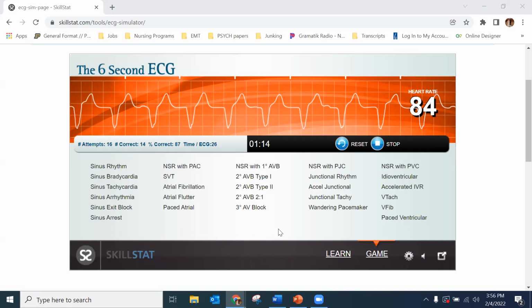Is that the PVC? So good question, actually. The PVC is just one beat that comes early every so often. So overall, I have a relatively normal rhythm, and every so often you'll see a wide complex. With this particular rhythm, every single beat is a wide complex, so that means the whole thing is coming from my ventricles. Is it accelerated IVR? Yeah, it's going to be an idioventricular rhythm because every single complex is super wide. So nothing's early necessarily, they just all are coming from the ventricles. And then it's over that 20 to 40 range of your Purkinje fibers, so it's going to be accelerated.